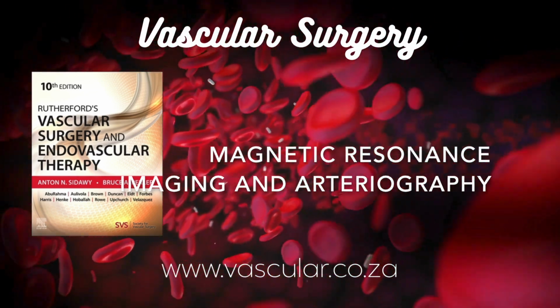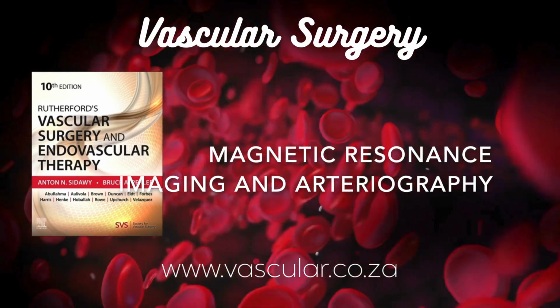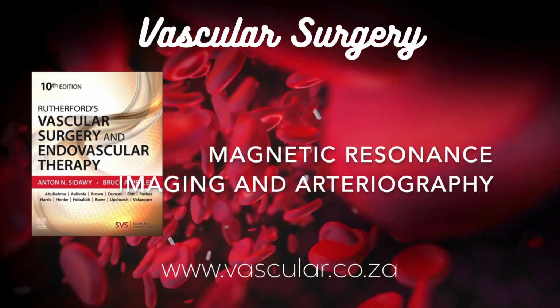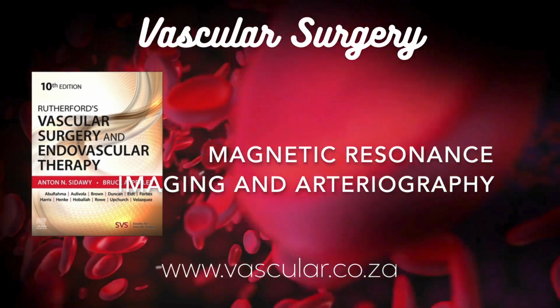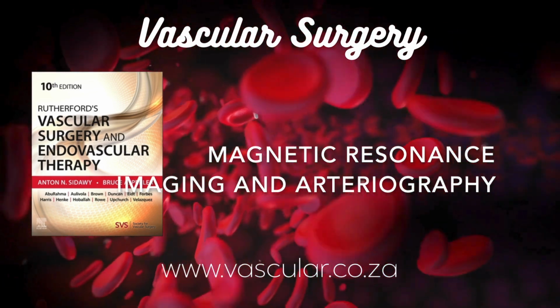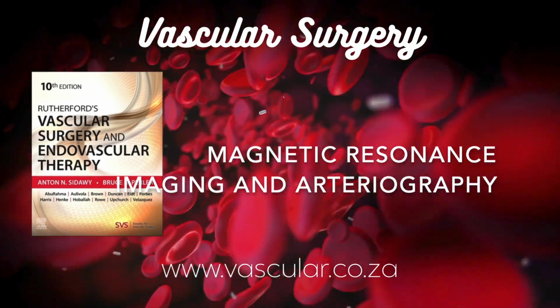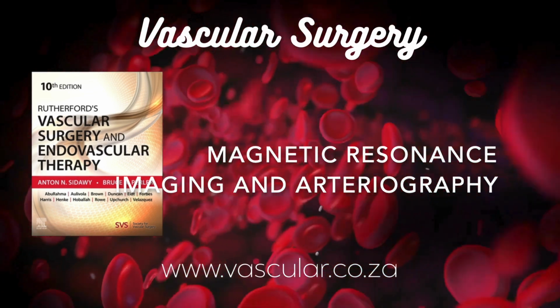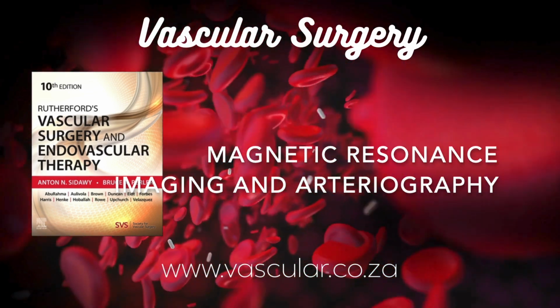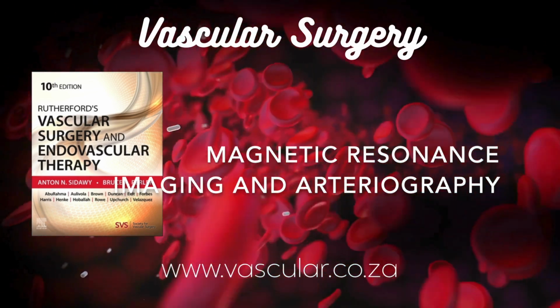CTA is usually a static snapshot, although the newest super-wide CT scanners might allow some dynamic imaging, but likely with higher radiation. How do they handle calcium and metal? MRI doesn't see calcium well, which can be a limitation sometimes, but it's also less bothered by artifacts from heavy calcium than CTA is. Both struggle with metal artifacts from stents or implants, though the artifacts look different. CTA is usually preferred for patients with non-MR conditional pacemakers.